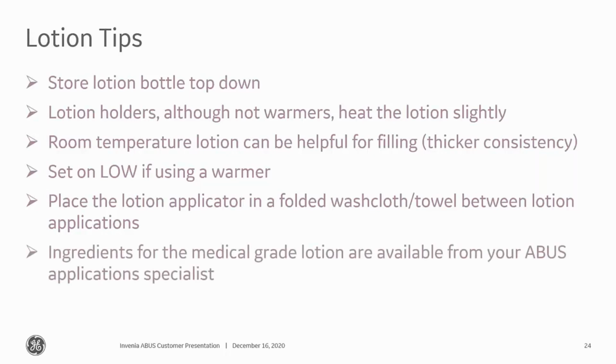And if you need the ingredients of the lotion, we can provide that for you. Just reach out to one of the application specialists and we can certainly give that information to you.